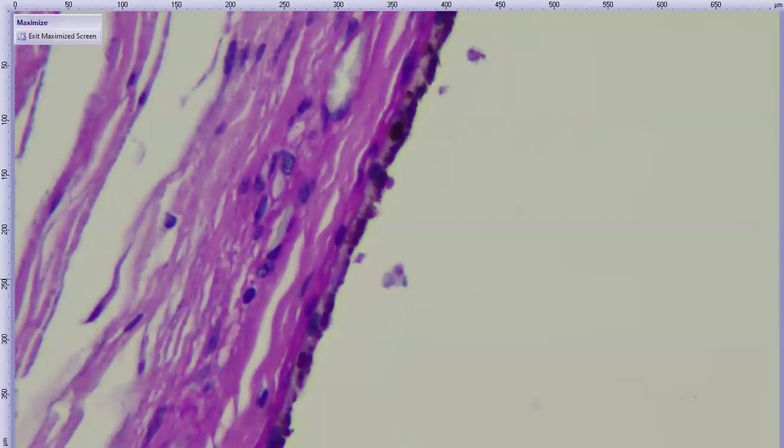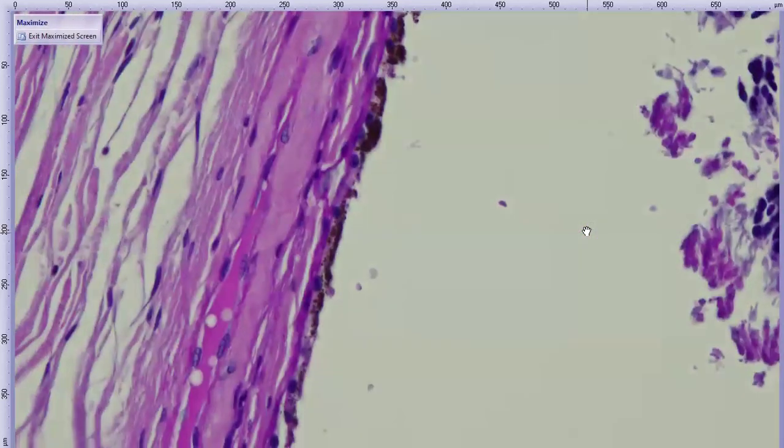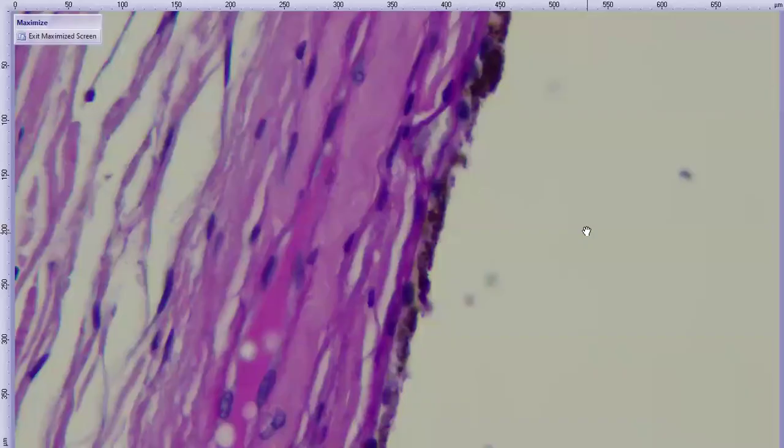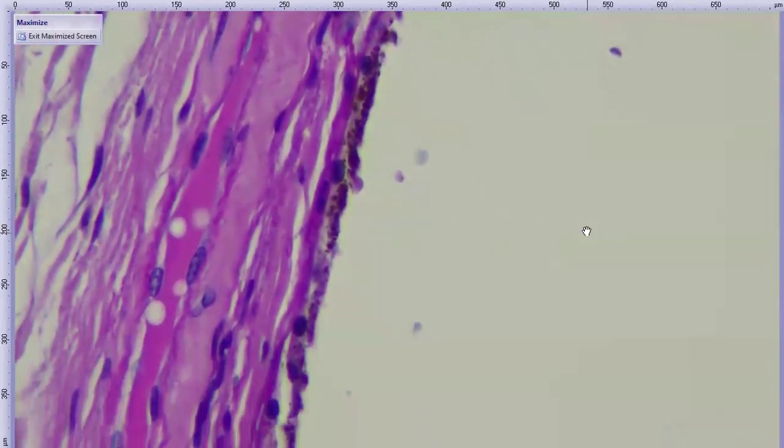Are you convinced that there is a little bit of pink in these RPE cells right here? What do you think? Keep looking and find another area. Yeah, dial your imaginoscope up to 9,000. Yeah, exactly. No, I see it. Yeah, like it's there. Here, for example, very subtle PAS positivity with respect to this stuff in the RPE cells.